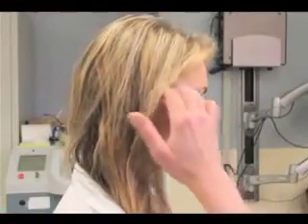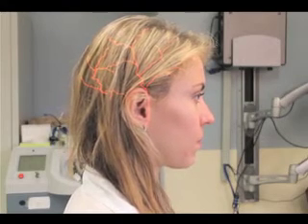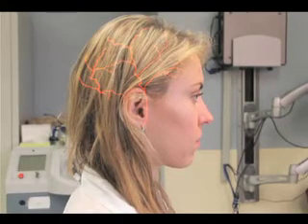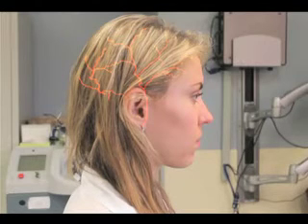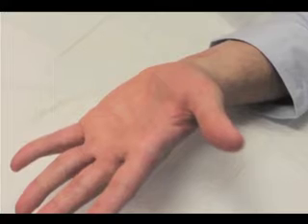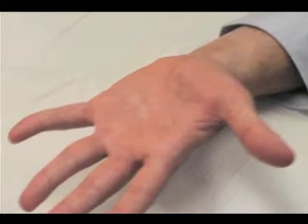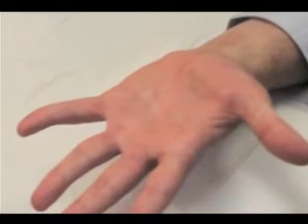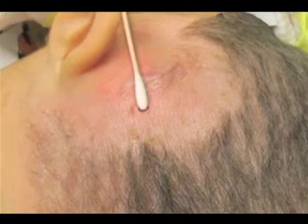Remember the anatomy when performing a punch biopsy so that you avoid damage to major blood vessels and nerves. For example, avoid punching medial and lateral digits and palpate for the temporal artery before biopsying near the temple. When performing a punch biopsy on the palm, recall that there is very little subcutaneous fat and that once the entire dermis is breached, the instrument is essentially at the level of the fascia. Consequently, do not press hard on the punch. When taking a specimen from the highly vascular scalp, be prepared for brisk bleeding.